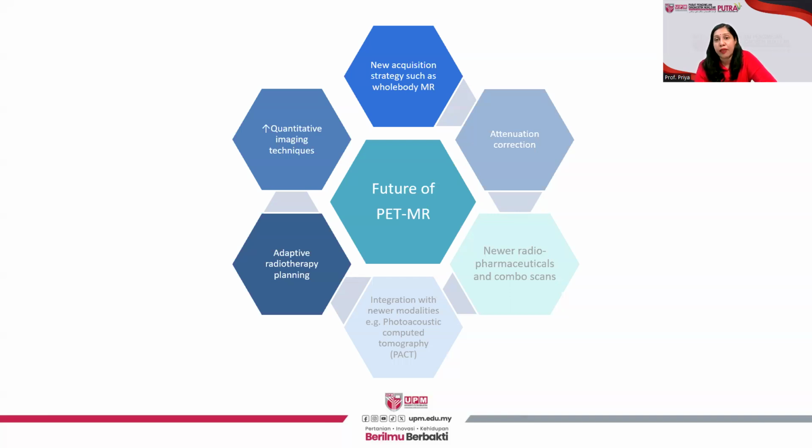It also can help improve quantitative imaging techniques with various MR sequences, and it can be used for adaptive radiotherapy planning throughout the process of the radiotherapy regimes. And with appropriate attenuation correction techniques continuing to be innovated, we can see a remarkable future for PET-MR scanners.